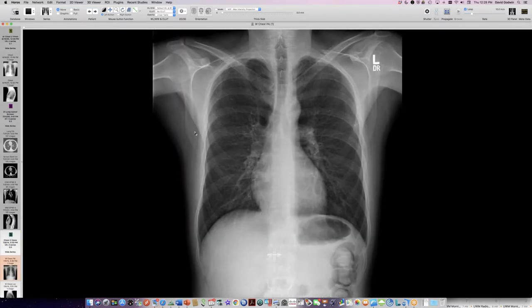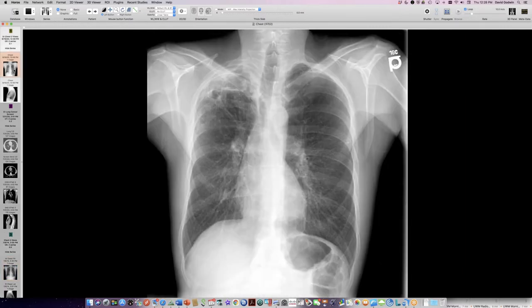EC. Okay, so here's a person who has this radiograph back in 2014, cigarette smoker, continues to smoke, probably has some emphysema up here. You can see some medial bullae here along the mediastinum, a little bit of scarring up here, not too scary, calcified granulomas here on the left and maybe the right. Over the years, we advanced to 2020, six years later, and we now see a cavitary abnormality here in the right apex, maybe with a fluid level up here, some cavities and some thickening over this. We still have the calcified granulomas there.